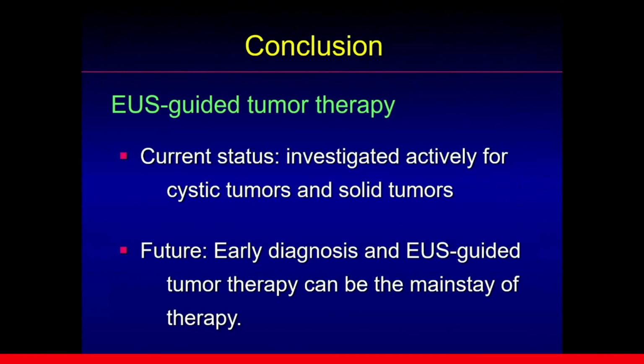In conclusion, at the current moment, EUS-guided tumor therapy is actively investigated for the management of cystic tumors and solid tumors of the pancreas. In the future, early diagnosis followed by EUS-guided tumor therapy can be the mainstay of therapy instead of sending patients just for surgery.